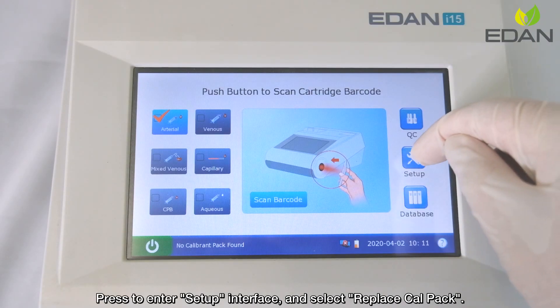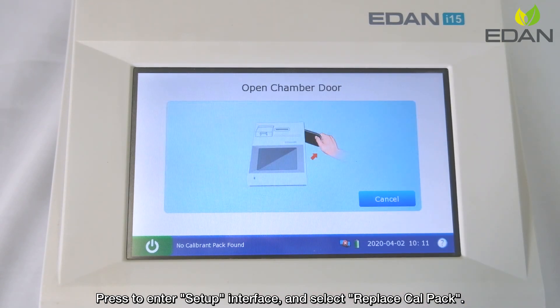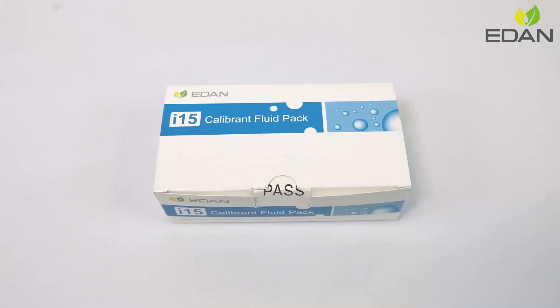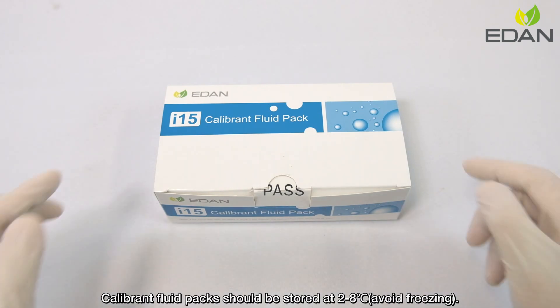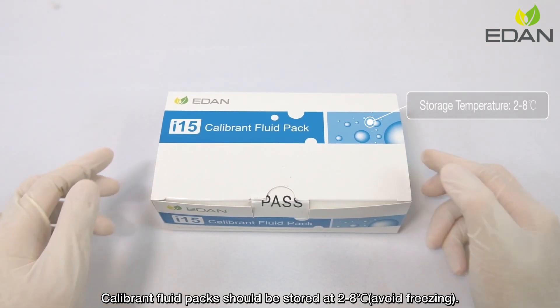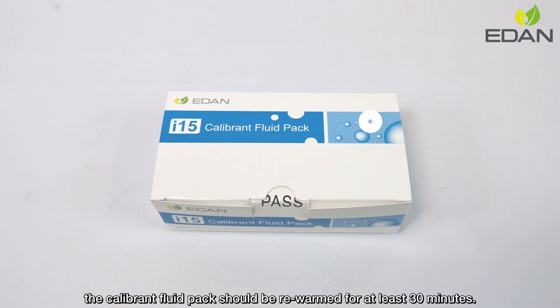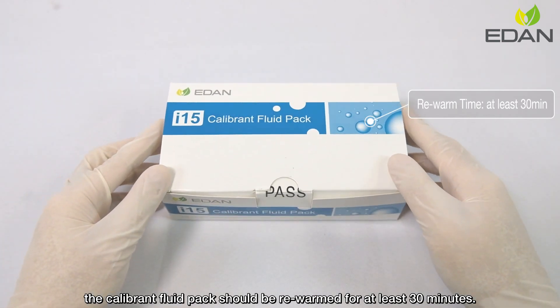Press to enter the setup interface and select Replace Calibron Fluid Pack. Calibron Fluid Packs should be stored at 2 to 8 degrees Celsius. Avoid freezing. Before installation, the Calibron Fluid Pack should be rewarmed for at least 30 minutes.